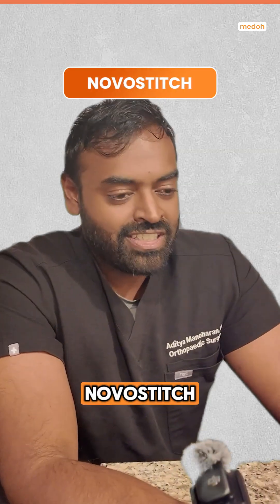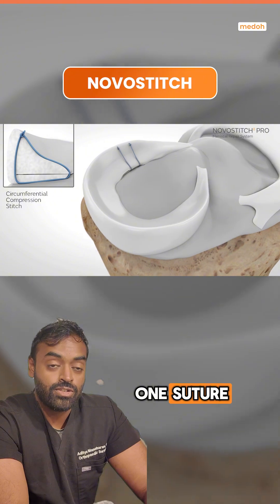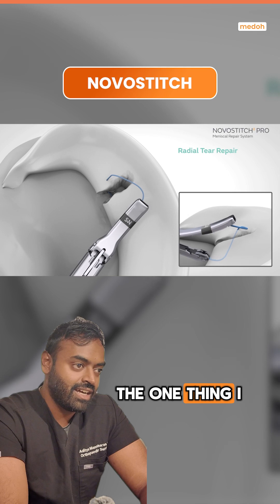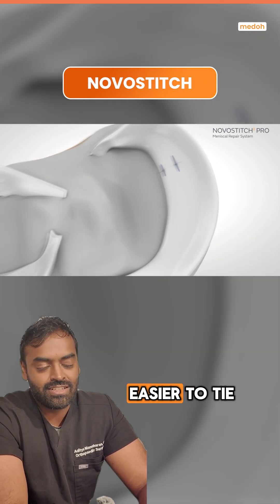Nova Stitch — another great device. 8 out of 10 for me. I think that having one suture being able to be passed all inside the knee is very nice. I think the one thing I wish is that the suture itself was a little longer to make the knots easier to tie.